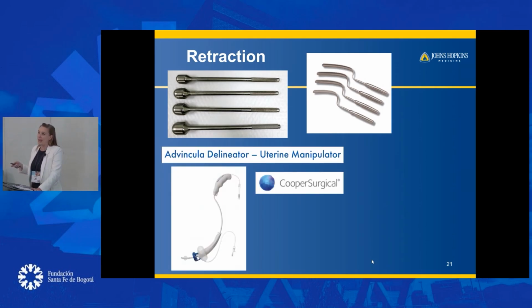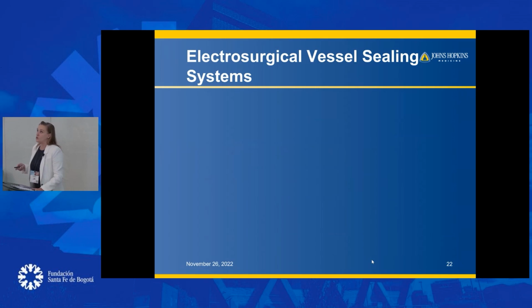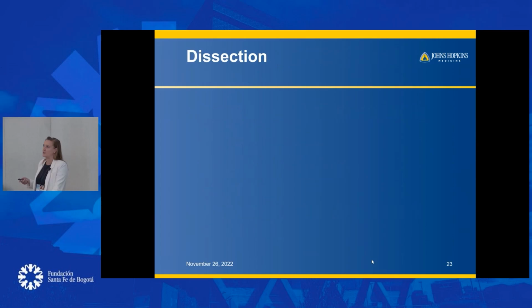In the States, we have some of these uterine manipulators. They're very expensive, but they're very nice tools because you can grasp the cervix and move the uterus to help with the dissection. And then they do have some reusable ones. And if you notice the curve, this is for someone that doesn't have a vaginal assistant. So they're actually having an assistant that's helping on the port, and then someone else who's, and they also have to use their other arm basically to do the vaginal retraction. So think about the setup. We have a lot of different tools to do the hysterectomy. We all use some sort of sealer or some sort of ligature device. I do not divide and ligate these independently.